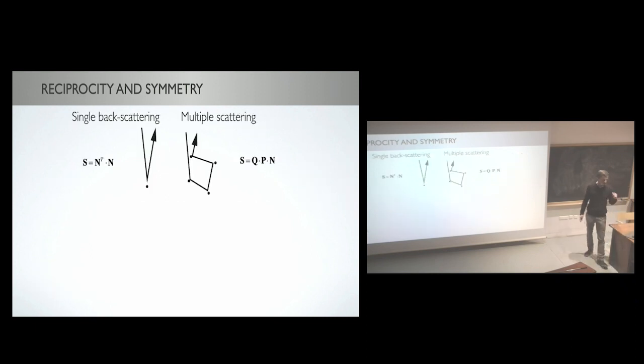I just briefly want to elaborate that this is not limited to a single scattering regime, but also applies to multiply scattered light. We'd like to think that we mostly look at singly scattered or ballistic light, but obviously part of the light is multiply scattered. In a single scattering regime, it's intuitive that you would get that transpose symmetry. But if you have a multiply scattered path, you can think of a sequential polarization effect taking place, which in itself doesn't obey the symmetry.